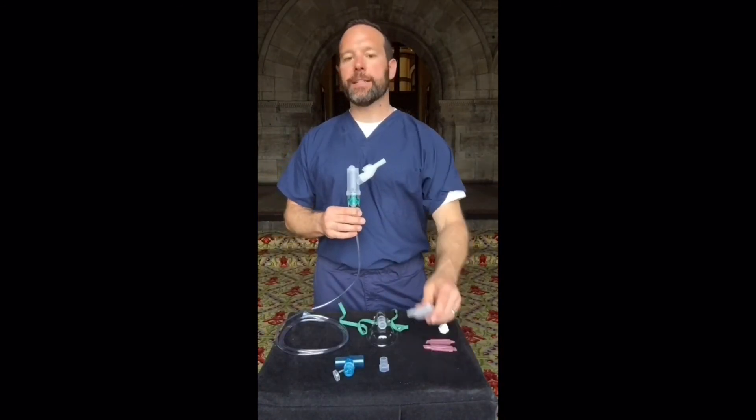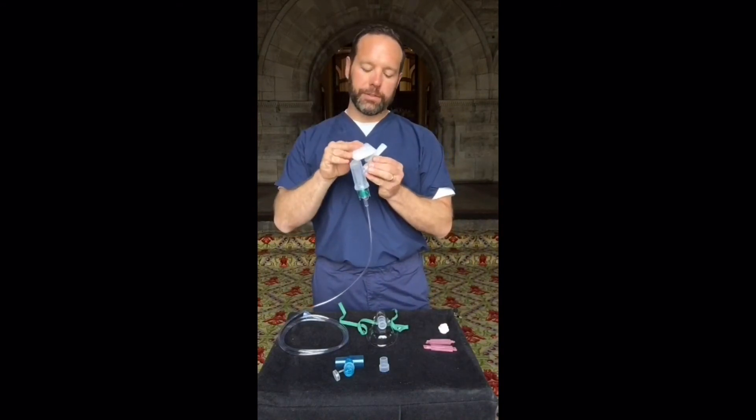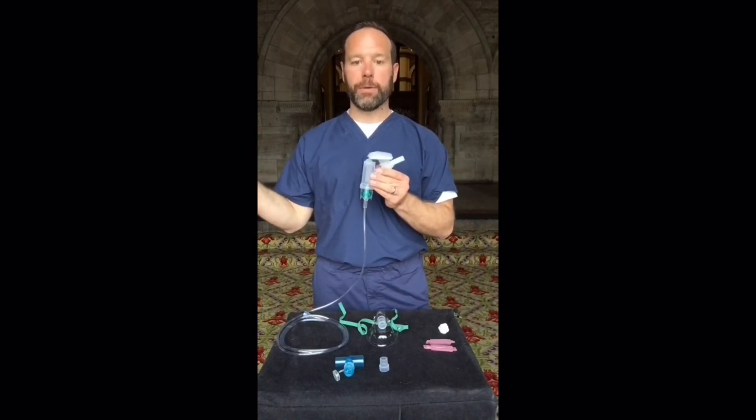One of the common accessories for the Nebutek is the expiratory filter. The expiratory filter directly fits onto the expiratory valve on the mouthpiece. Ensure that both vents face away from the patient when being used.